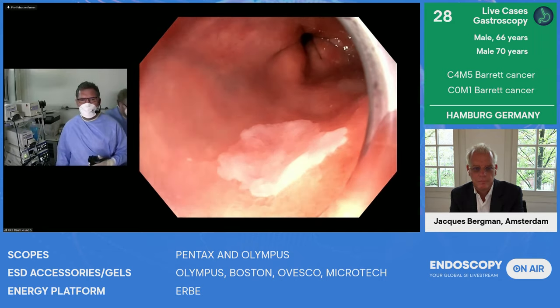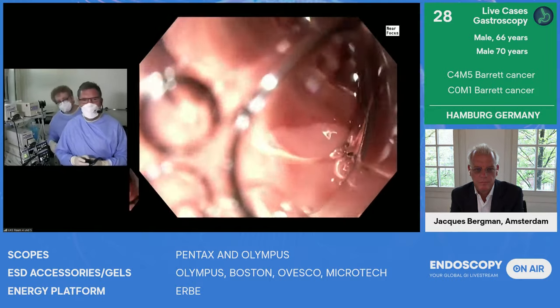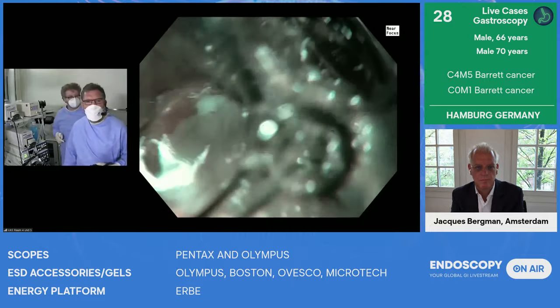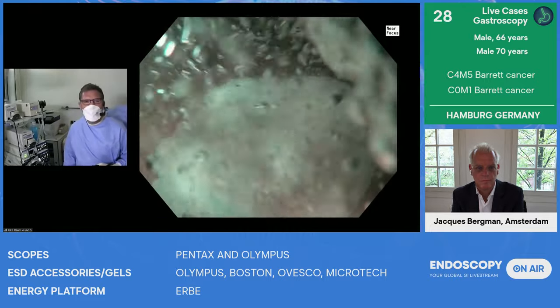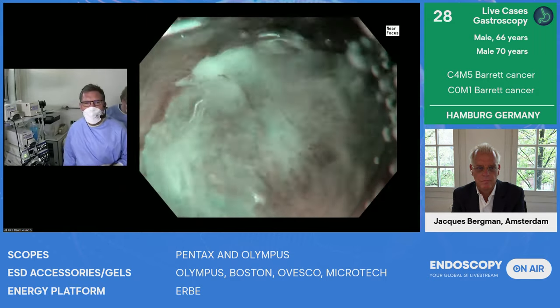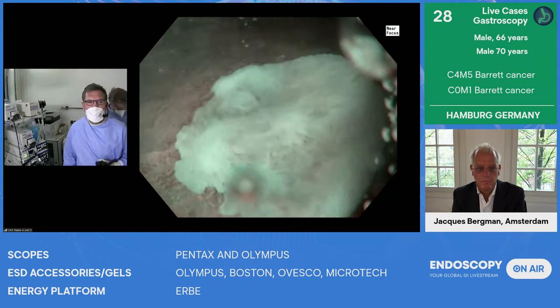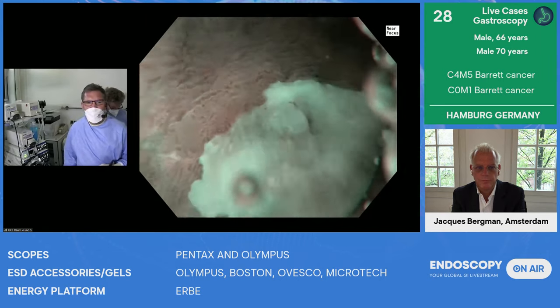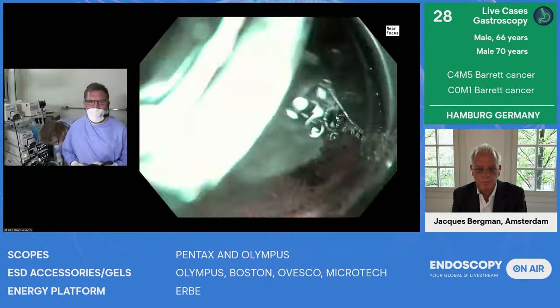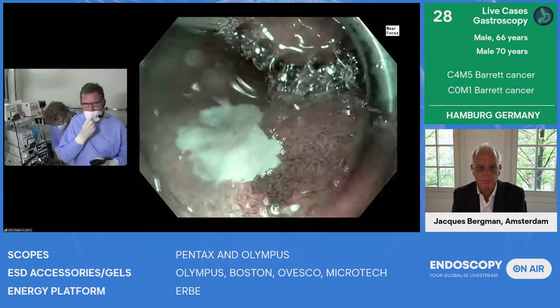Yeah, once again, this is now our small island. It's a bit depressed, and now going to the near focus and to the zoom, to NBI and maybe a bit underwater. Then you can nicely see there is a scar. Here the biopsy was obviously taken, and there is the cancer, obviously this nodule. And in the previous image from Thomas, here was this suspicious area. So I think the cancer is growing below this island, and it must be fibrotic. So from my point of view, it is a nice indication for an ESD procedure.